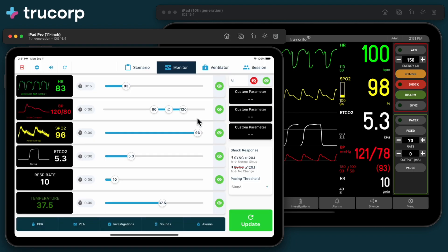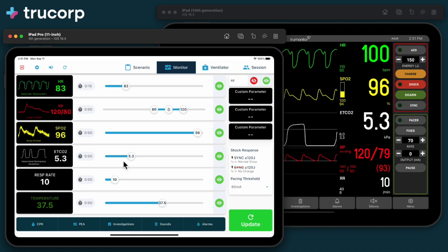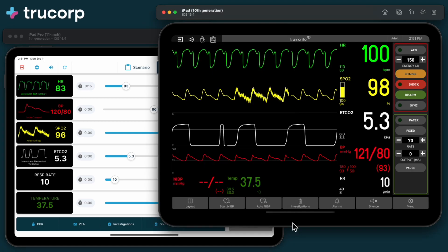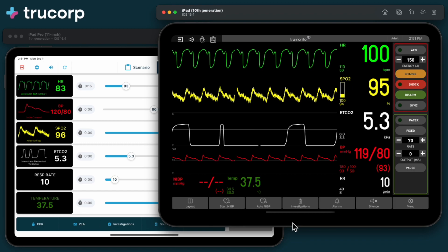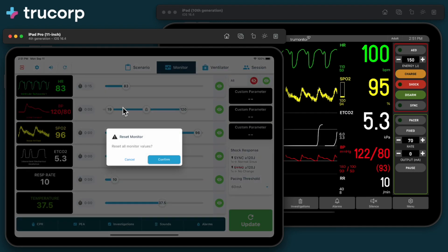Prepare any waveform and value changes you want to make, then press update to send the values to the monitor. Press reset to restore the monitor to the default state.